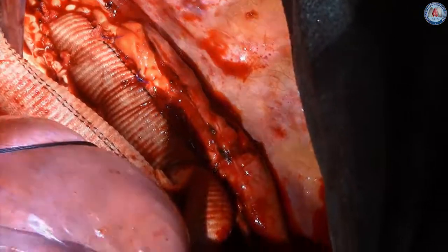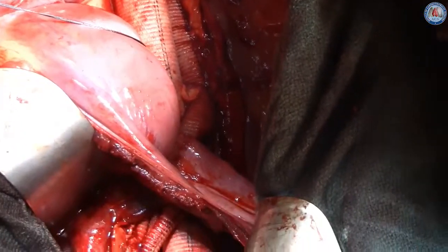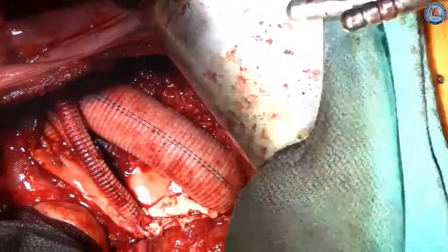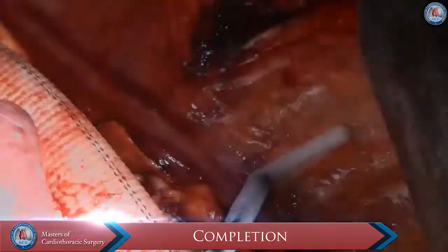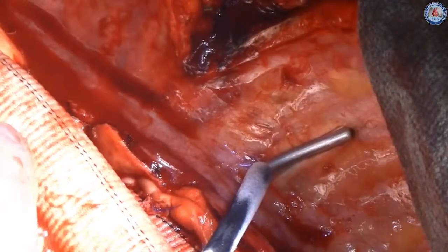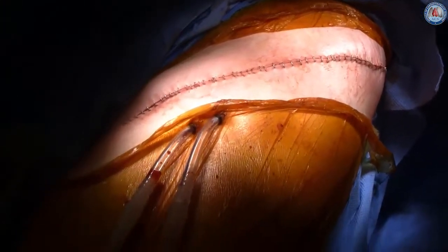The patient is then decannulated so as to be off distal aortic perfusion and anticoagulation reversed. Hemostasis is now confirmed throughout the entire repair. Before closure, we utilize cryoanalgesia by cryoablation of the intercostal nerves T4 through T10. Standard closure of the thoracoabdominal incision is performed with drainage tubes left in place.